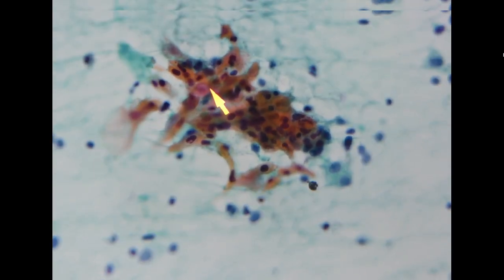Some cells even show a little bit of spindling. When we start to see keratinized cells with nuclear atypia, we should be a little bit more alert. If these are all parabasal cells, these are fine.